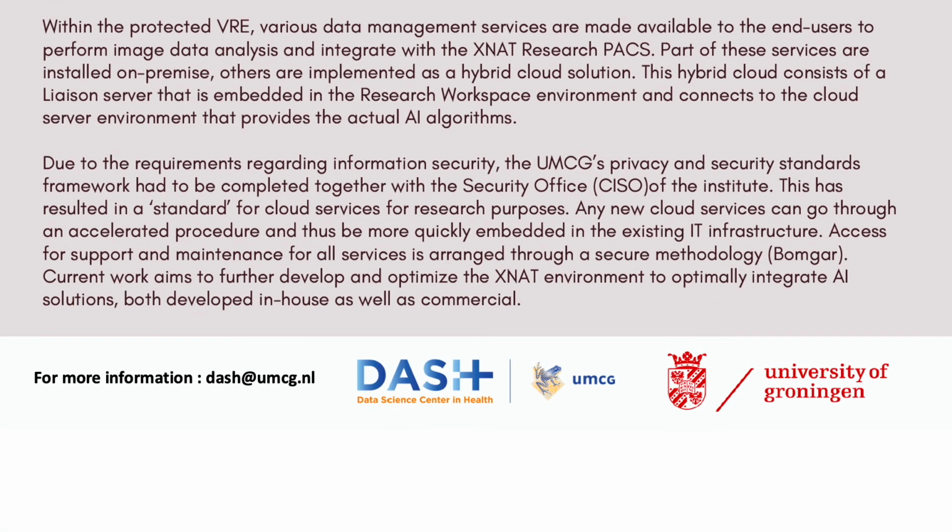Part of these AI tools are installed fully on-premise. Others are implemented as a hybrid cloud solution consisting of a liaison server embedded in the research workspace environment and connected to a cloud server environment that provides the actual AI algorithms.